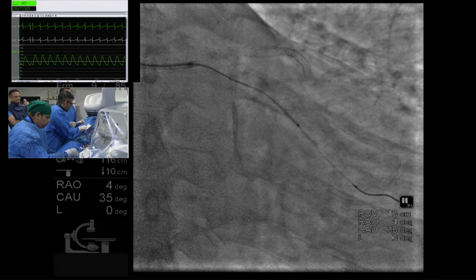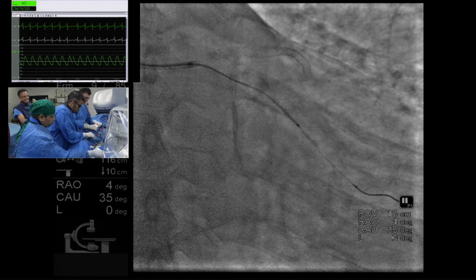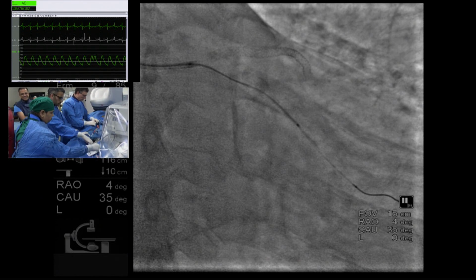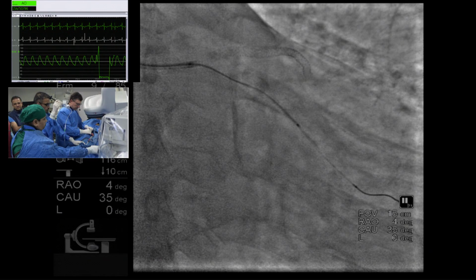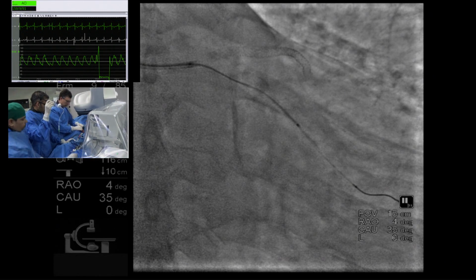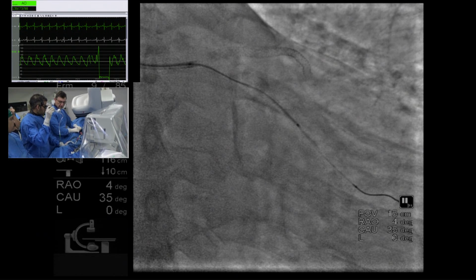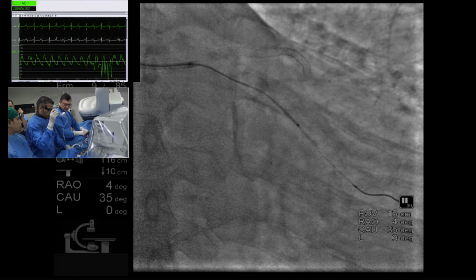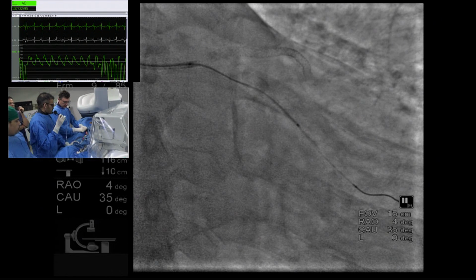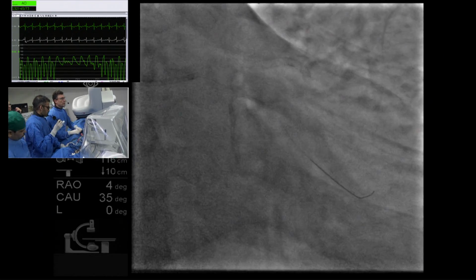Because I want to see how the vessel reacts to the balloon inflation. By principle, I usually use non-compliant to post-dilate and compliant to pre-dilate. The balloons are more flexible, and you can see the waist on the balloon a little bit better when you use compliant. Maybe that's my own personal bias based on nothing, but... Even after this OCT finding?